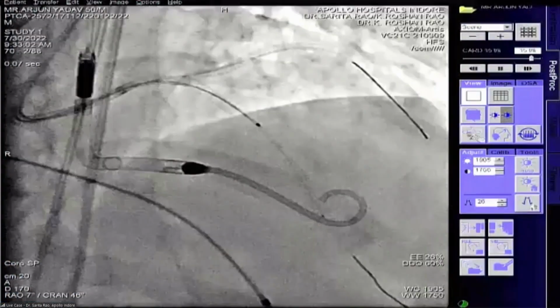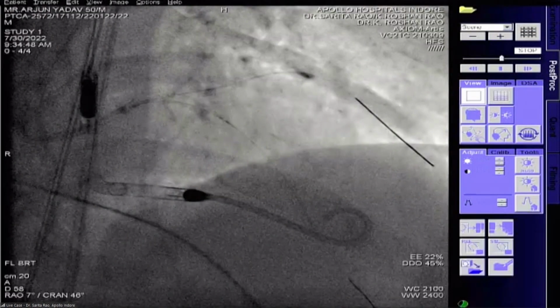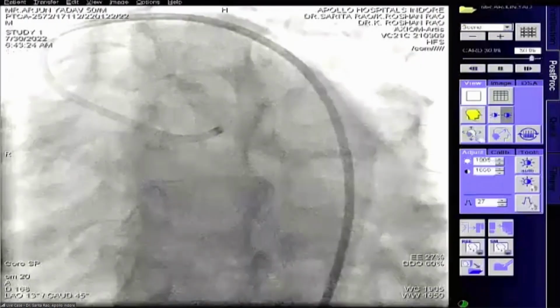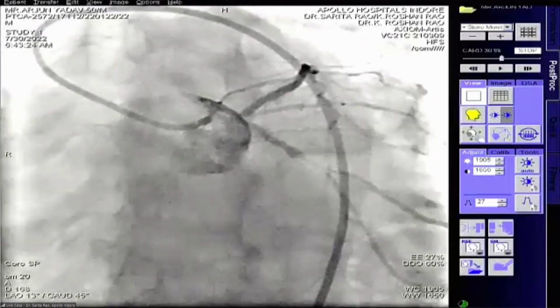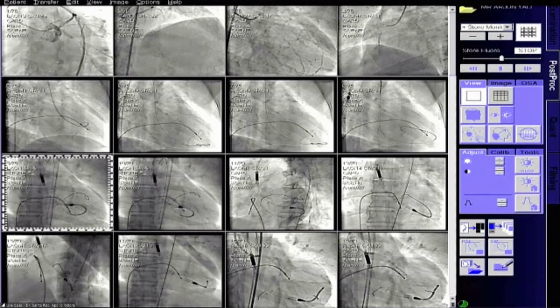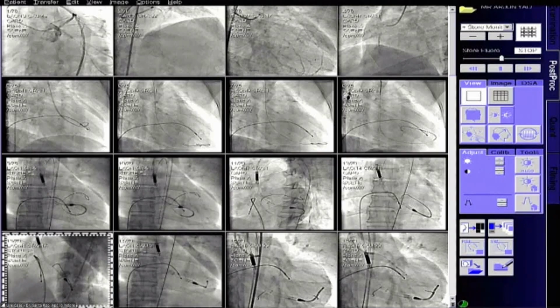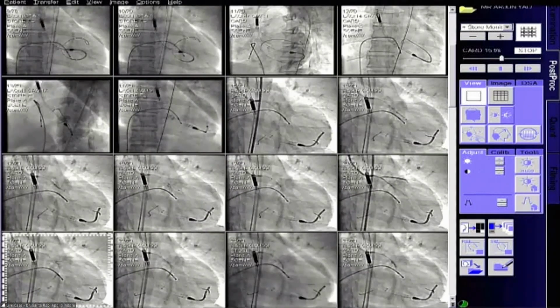So, welcome back. Yeah, madam. So, we went in with a 4 by 6. Can you go to the point where we stopped live transmitting? So we went in with a 4-6 for the POT, and we dilated the LAD with a 3.5.